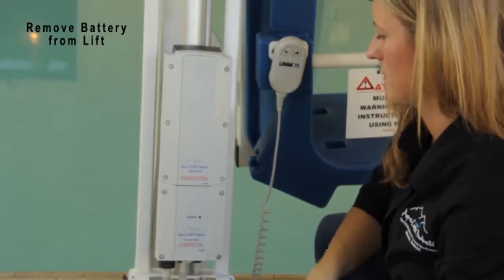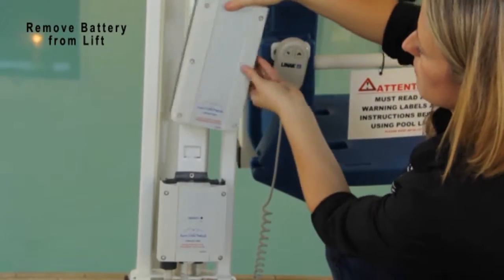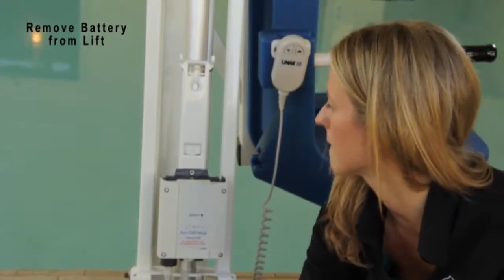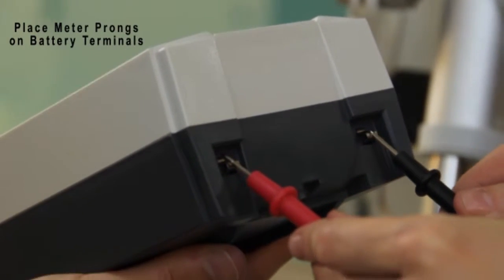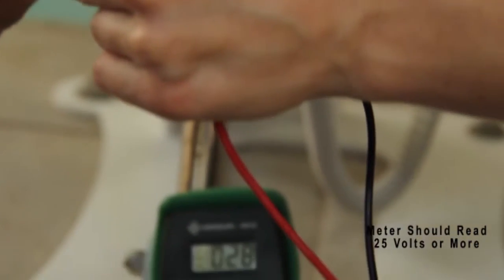Remove the battery from your lift. Using a voltmeter, place the prongs on the two terminal tabs. A fully charged battery should read 25 volts or higher.